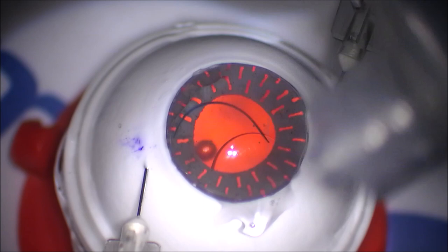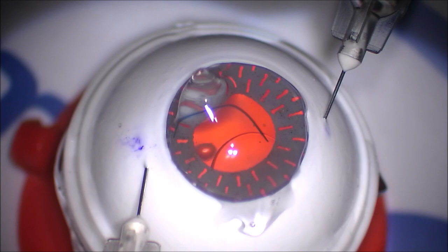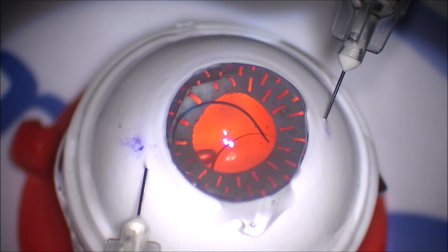I'm just putting a little bit more coating gel here. And you know, you could be a bit more generous than I am. I just don't want it to be spilling all over the sclera and getting all over the place. So I'm a little bit ginger about how much of that coating gel I'm putting on the eye.